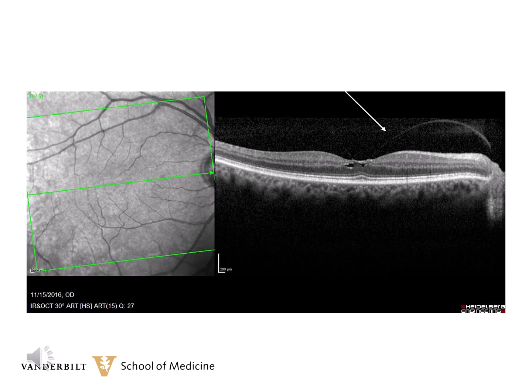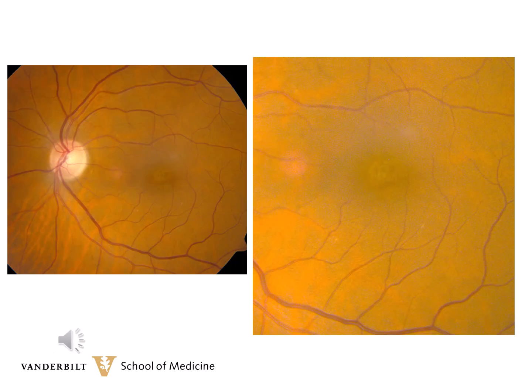You can see here that the arrow points to the vitreomacular traction, and there are some very small inner layer retinal cysts. This again would be stage 1 or an impending macular hole in the international classification. This is another example of a stage 1 or impending macular hole according to the international classification.